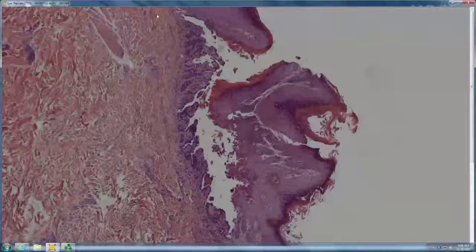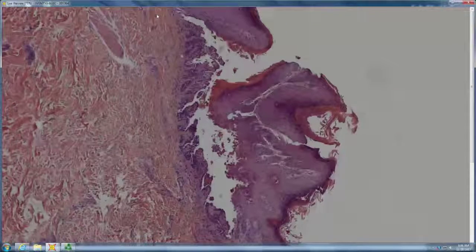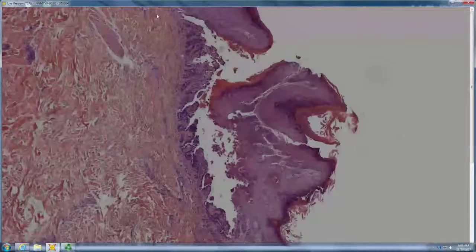If it's a solitary lesion, this would be good for a warty dyskeratoma, but this was by history a patient with Darier's. Looks the same. It's just acantholytic dyskeratosis with red, blue, and clear rings.